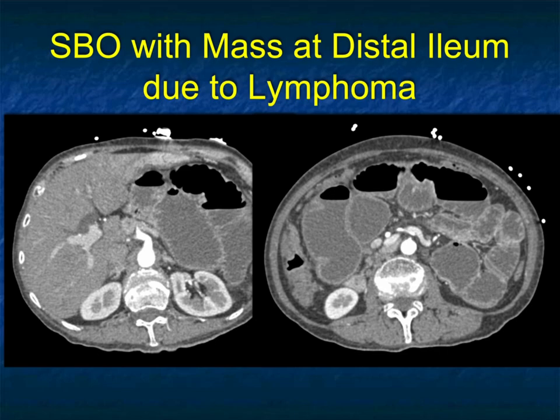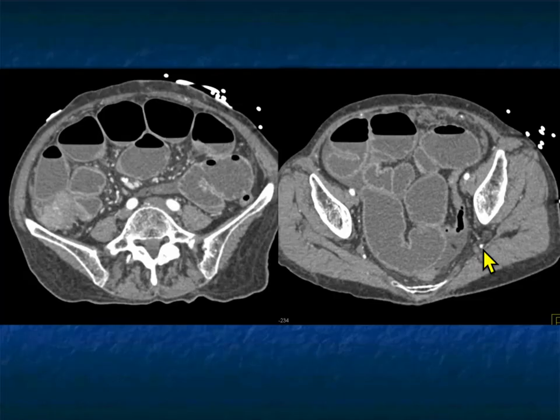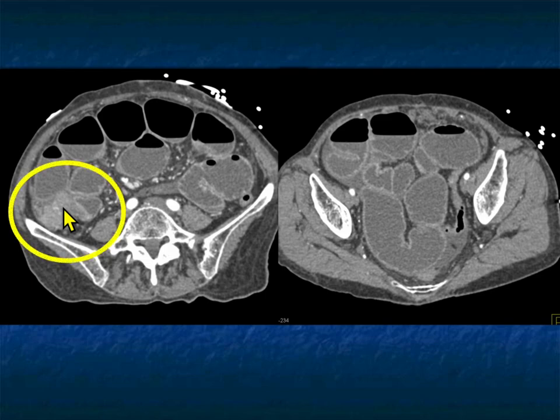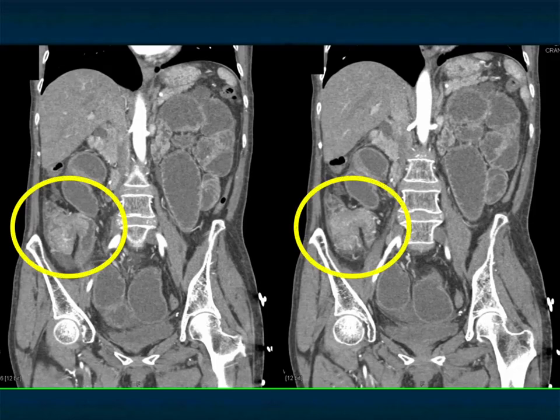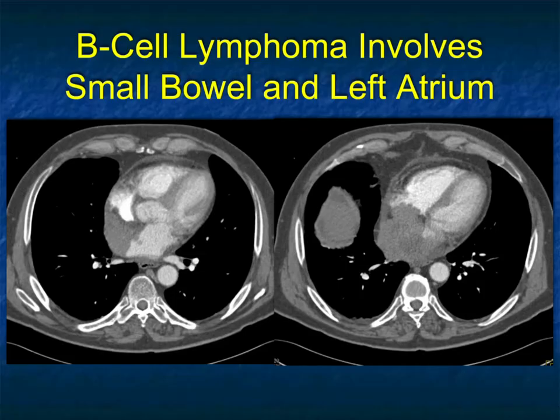I mentioned that tumors are often bulky but don't obstruct — but here's an example of a patient presenting with bowel obstruction. You see markedly dilated bowel loops. Following downward to the terminal ileum near the ileocecal valve, there's a mass present, nicely shown on the coronal view going from the terminal ileum into the cecum. When a lesion involves the ileum and cecum, it's typically not going to be adenocarcinoma — it's typically going to be lymphoma. In this case, obviously, the lymphoma does obstruct the patient's small bowel.